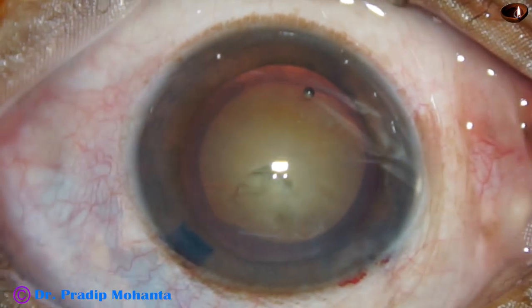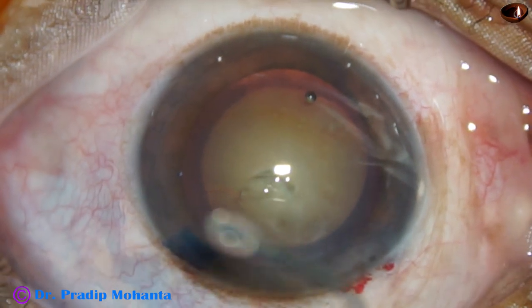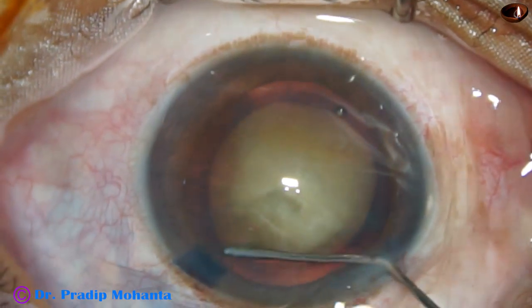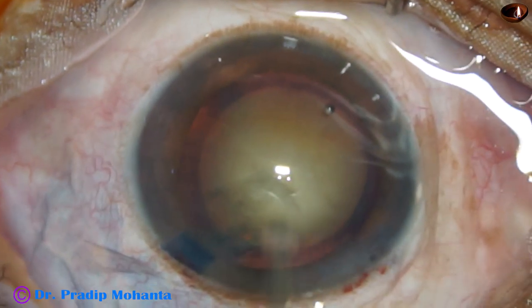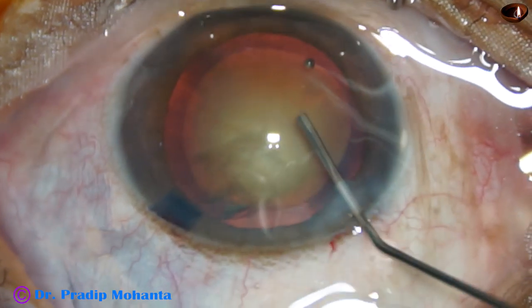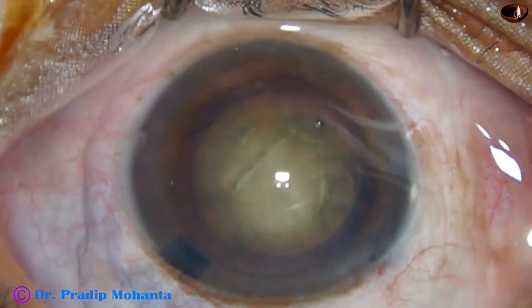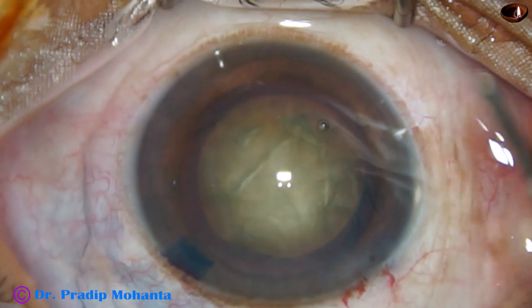Now hydrodissection is done with a 27-gauge cannula, and BSS is injected just under the anterior capsular rim. The fluid wave should go from one side to the opposite side, and the nucleus is tilted and rotated.